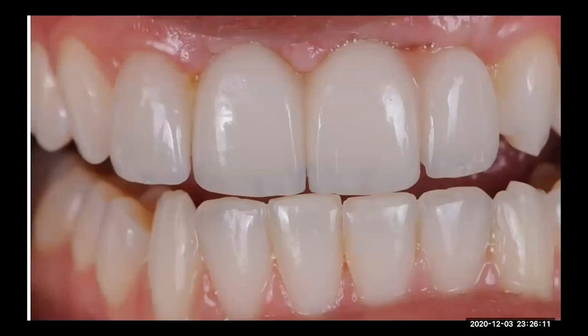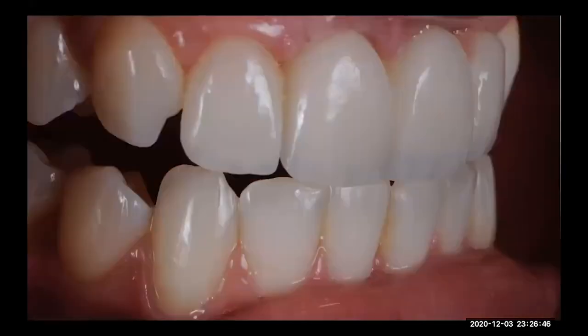But you see the vitality of the incisal edges is not ceramic, it's not buccal buildup. It's something that we create from the palatal of the tooth. So we can create shape, we can create value, we can control the value. Value is really important, more when you try to use A1, B1 colors. If you put too much clear enamel in an amount that is not proper, you will get low value restorations. Okay. So this is the close up of the restoration.